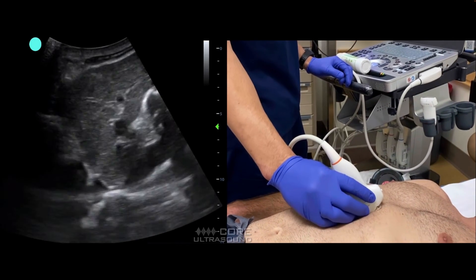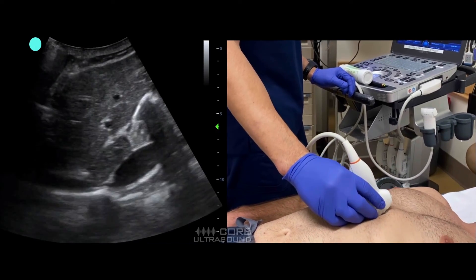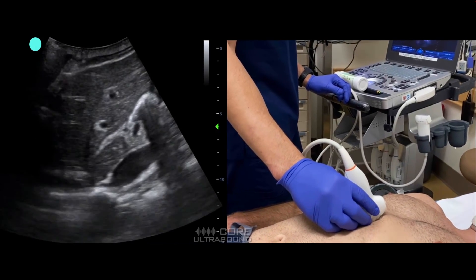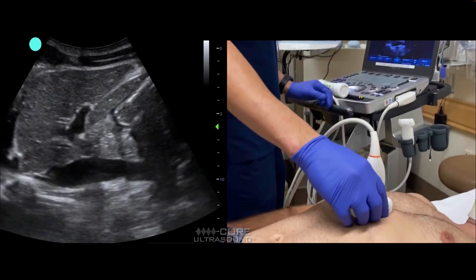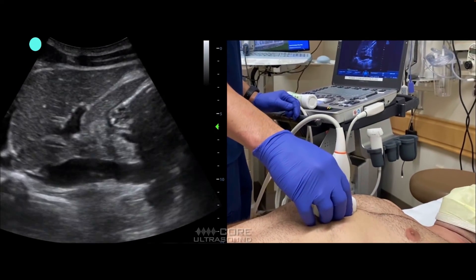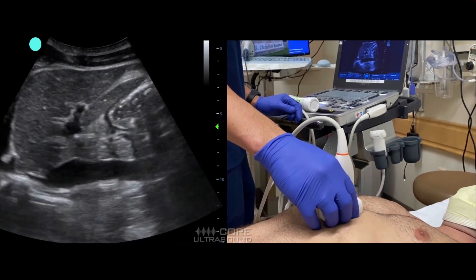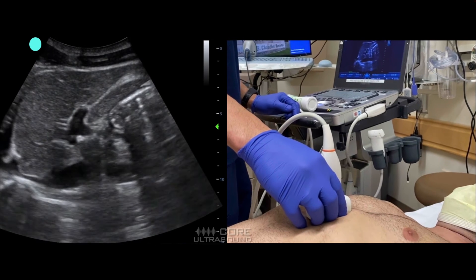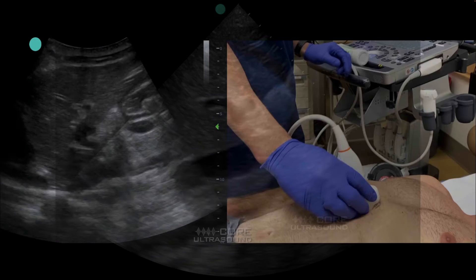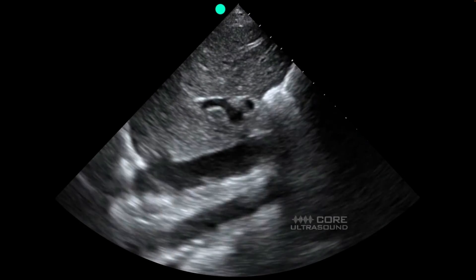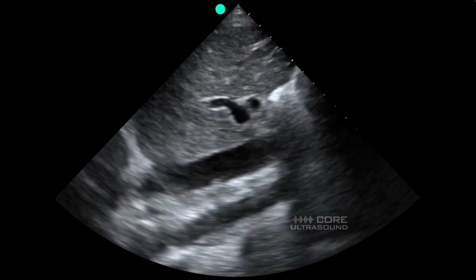Sometimes we get a tilted view of the IVC. The way to fix that and make it more horizontal for a better measurement is to tilt the tail of the transducer so you're more perpendicular with the IVC itself — basically perpendicular to the bed behind the patient.